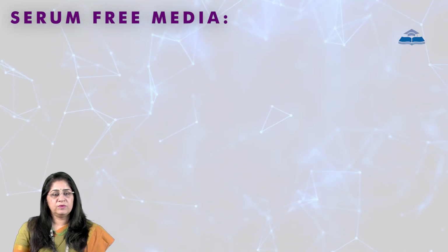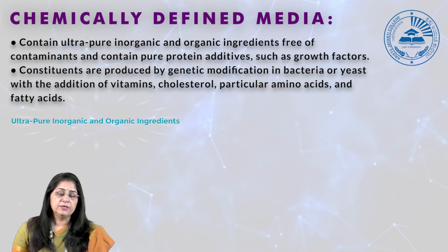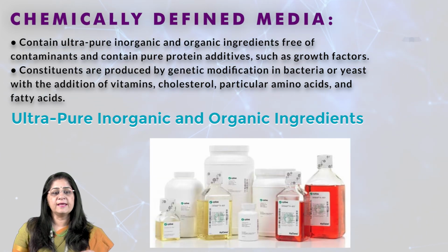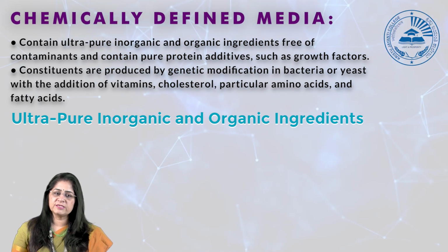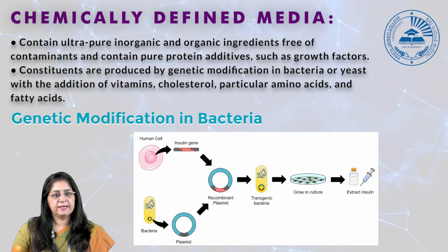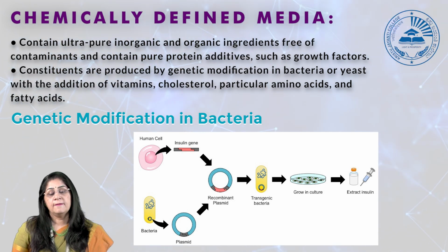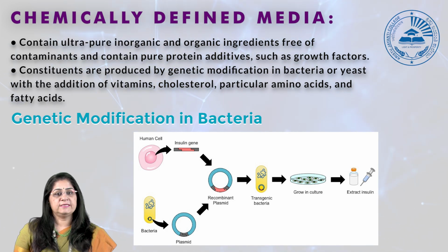Then this is very common nowadays, the chemically defined media. So depending upon what you require, accordingly you add the factors. So it contains ultra pure inorganic and organic ingredients which are free of contaminants and contain pure protein additives such as growth factor. So chemically defined media contains the protein additives and growth factors, and constituents are produced by genetic modification in bacteria or yeast with the addition of vitamins, cholesterol, particular amino acids, and fatty acids. So chemically defined media is totally different from your serum free media.